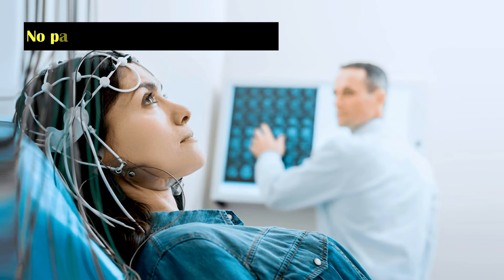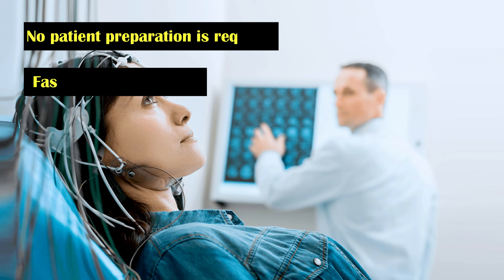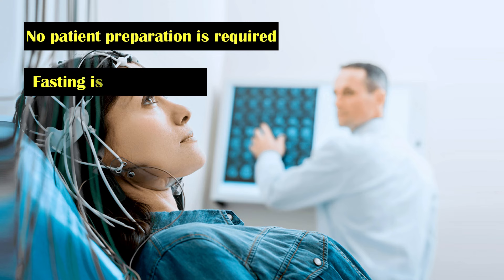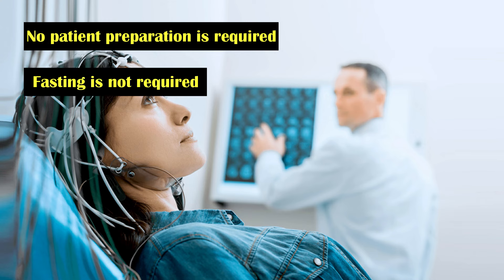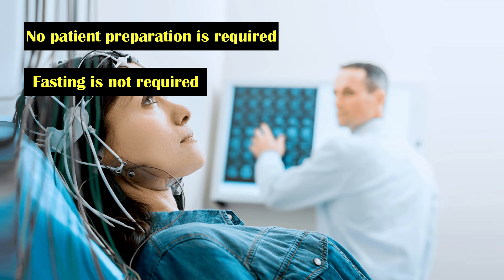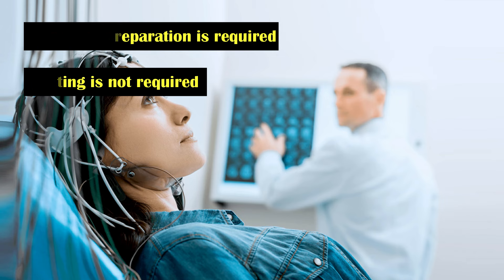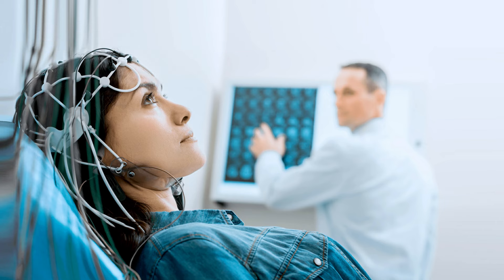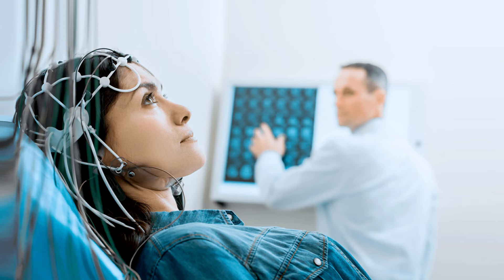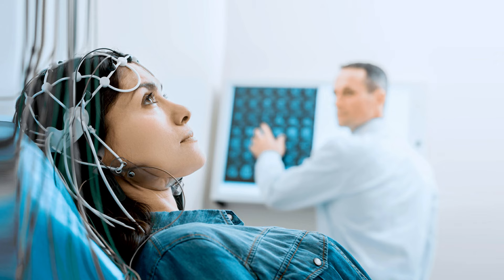No patient preparation is needed before the test, and fasting is not required to undergo an electroencephalogram. Patients should make sure their hair is clean and dry, and they should be advised to avoid applying hair gel and wax before coming for the procedure. Before starting the test, the scalp should be cleaned.